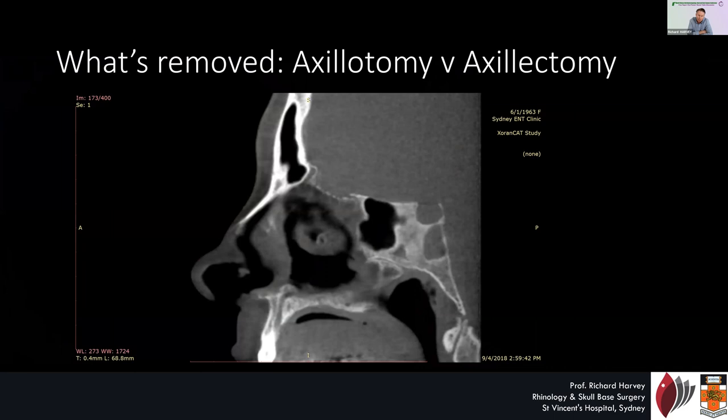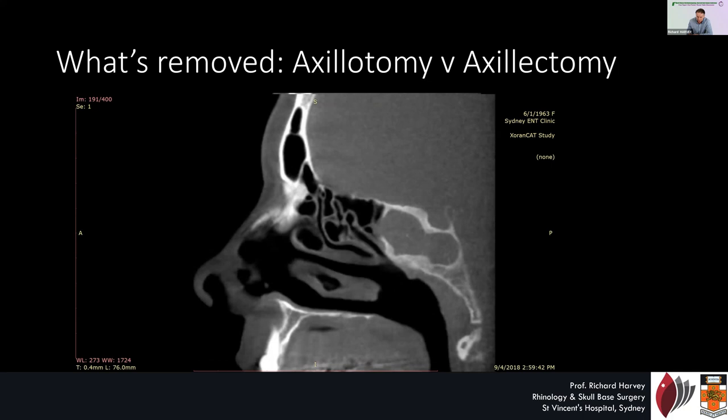But it's now become something we use all the time. If you look at a sagittal view — this is the midline — this is not really where you are when you do frontal sinus or frontal recess surgery. You're parasagittal, off the midline. And it's about this view here where you can see the beak and the agger nasi. This bone here is what we remove.